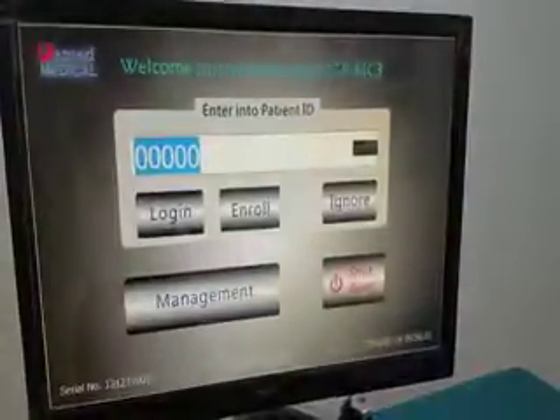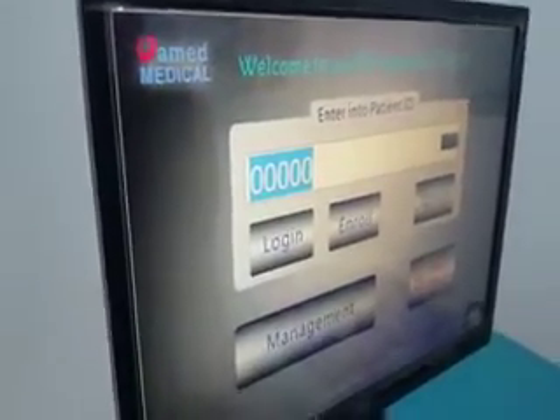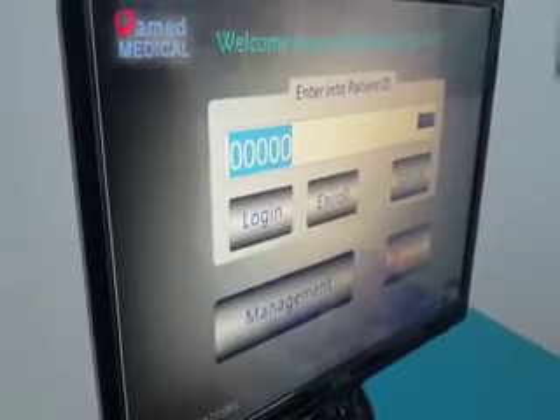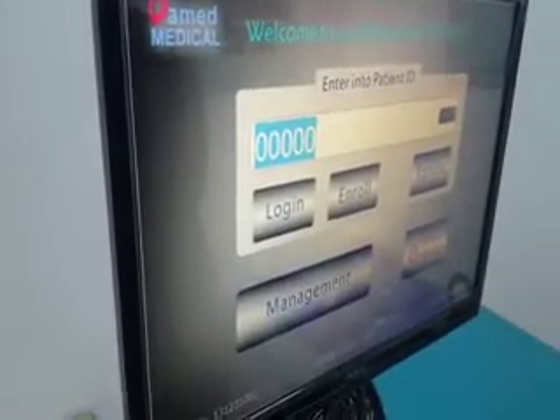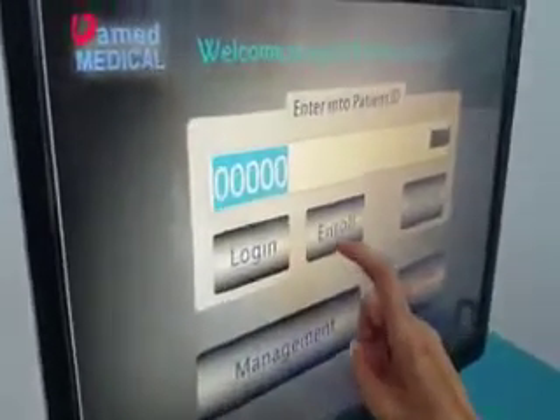When a new patient comes to accept treatment, we need to enroll this new patient. Now we will enroll a new patient.